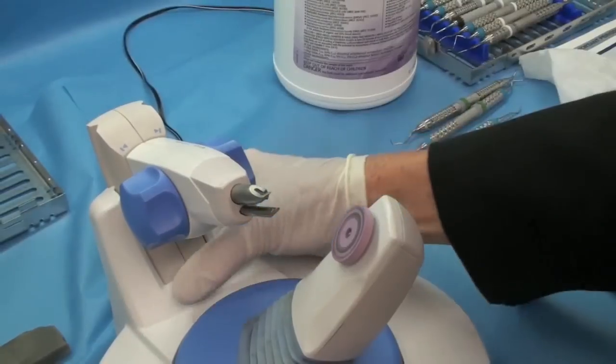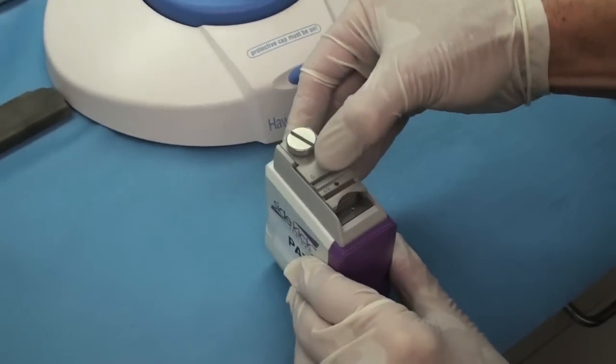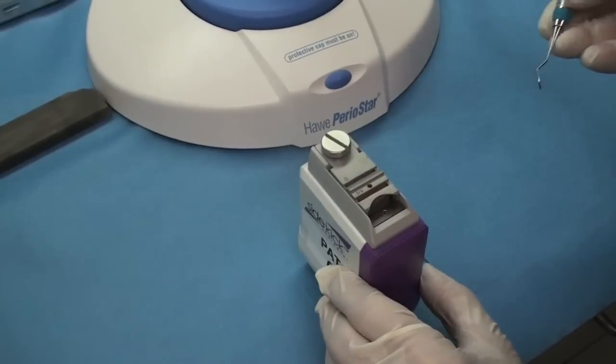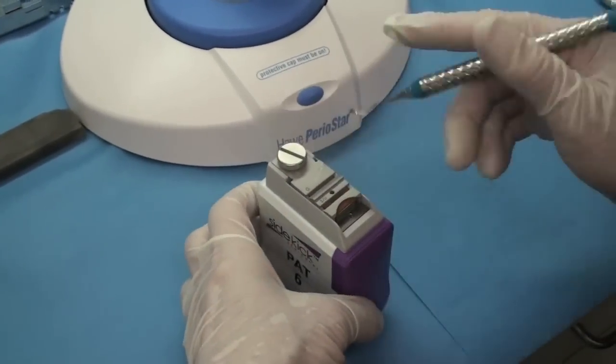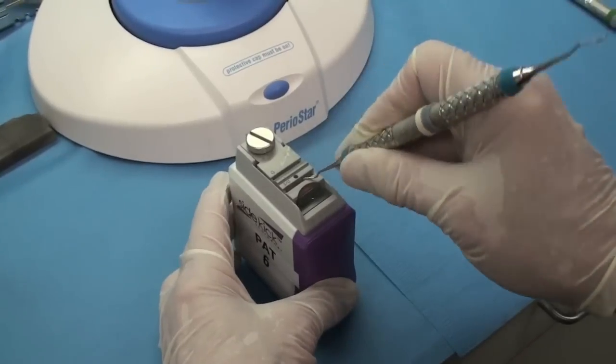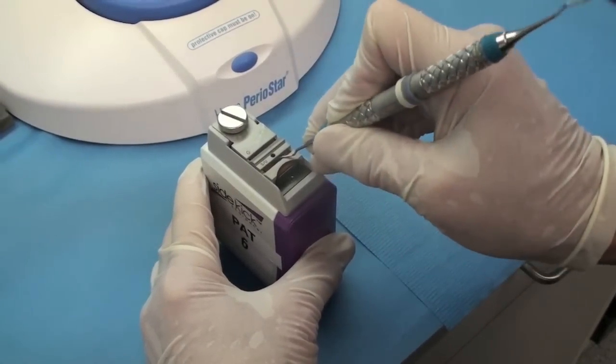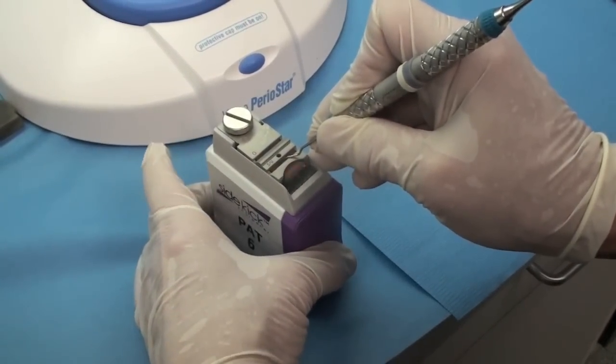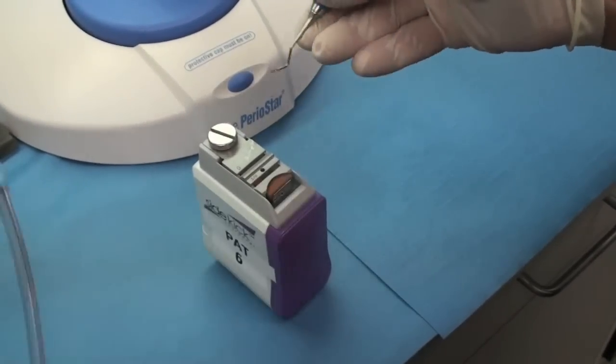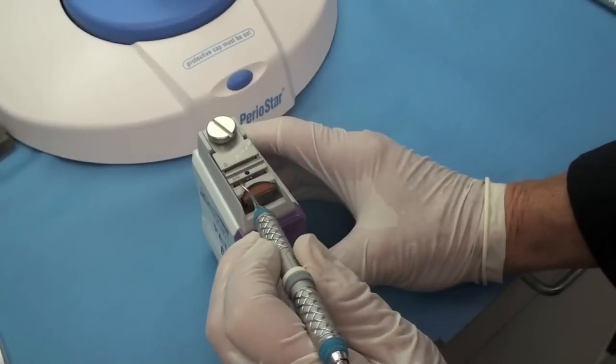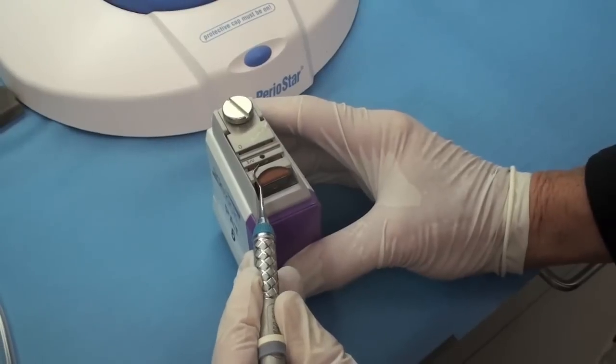So if you're going to use the Hu-Friedy Sidekick, you would do the same thing. It's got a line for Gracey's and for scalers and universals. So here's my universal. It's got a little power switch. I like to get it in the position first. You put the back of the instrument against the back and then you hold it flat. And then you do the other side the same way. The back against the instrument and you hold it flat.